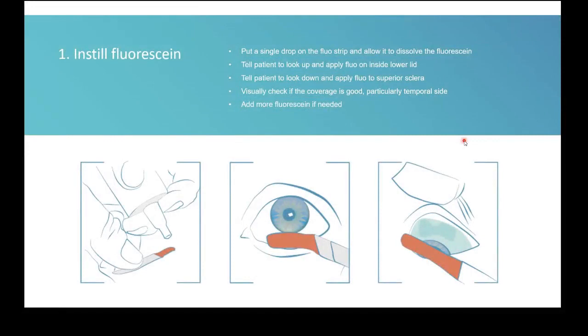We have to use fluorescein if we want to take an image from the sclera. Without fluorescein, it is impossible to measure the shape of the sclera when you rely on profilometry. That means that we are measuring the concentration of fluorescein within the tear layer. So it is important to make sure that the tear layer is in a good condition.